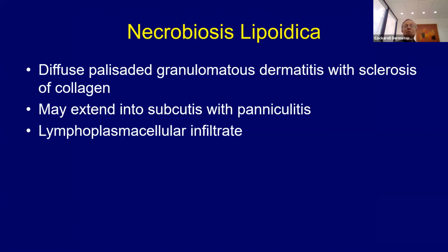And even though we call it eosinophilic fasciitis, they may not have that many eosinophils in the actual tissue. It's more of a circulating eosinophilia. And usually, in most cases that I've seen, you do actually get some eosinophils in here as well, but you don't have to see a lot of them to make the diagnosis. So again, it's often seen in association with the circulating eosinophils, although it is often present in the actual thickened septa as well.